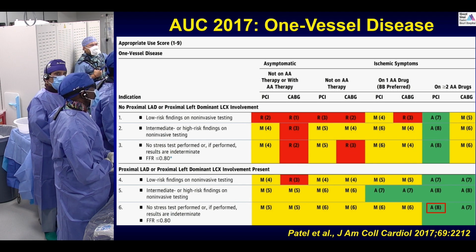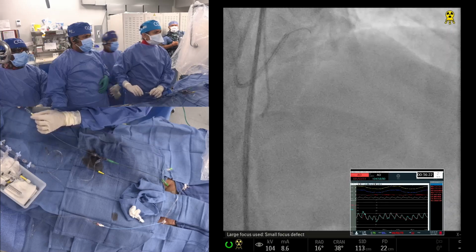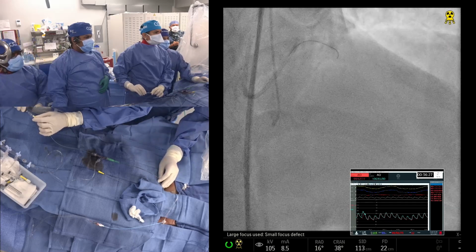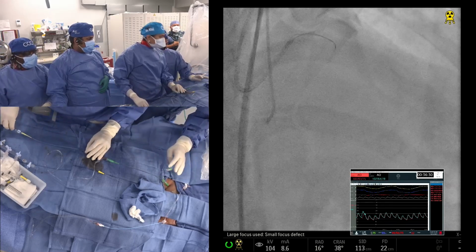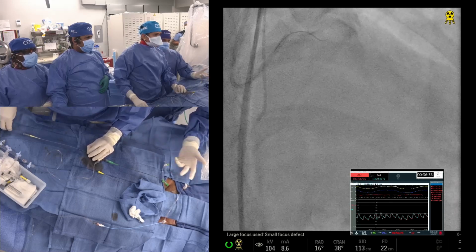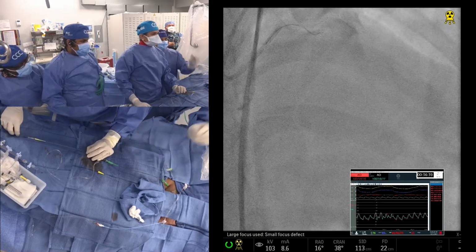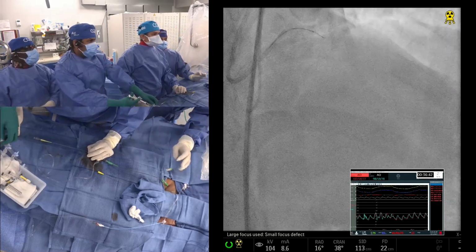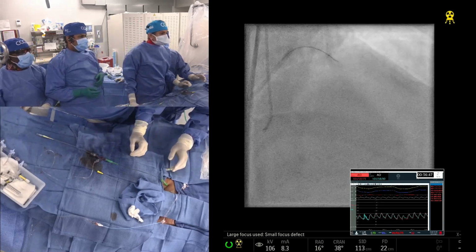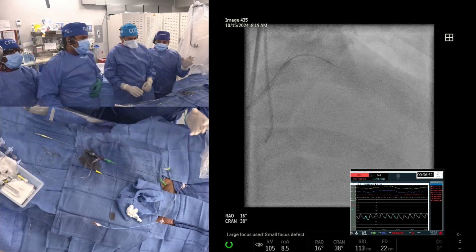Let's go on fluoro again. Okay, so we are coming with a Fielder and fine cross. With the modification in the calcification, the J-CTO score of course changes. So J-CTO becomes 3, because that angle is there, because it's a very small stump, whether it's a blunt cap or an ambiguous cap. If it is a clear-cut taper, then it becomes 2. But here I think with the guide it's a little better.